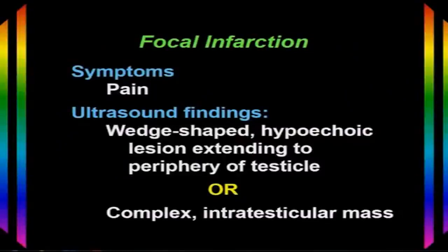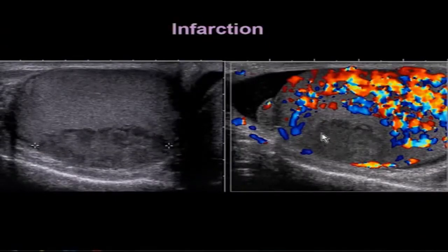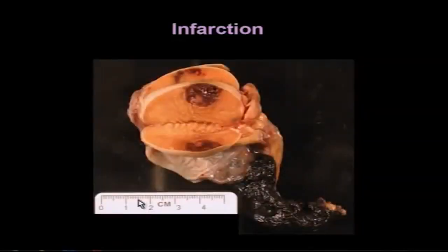Occasionally patients suffer a focal infarction, which tends to occur in older patients who present with acute pain. What we'll see is either a wedge-shaped hypoechoic area at the periphery of the testicle or a complex intratesticular mass — these are indistinguishable from tumors. Here's a patient who has an infarction: a focal well-defined lesion at the periphery of the testicle without blood flow, whereas the testicular parenchyma does have flow. This was still concerning for malignancy, so it was removed, and pathology showed focal infarction.